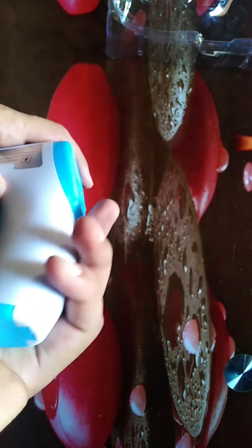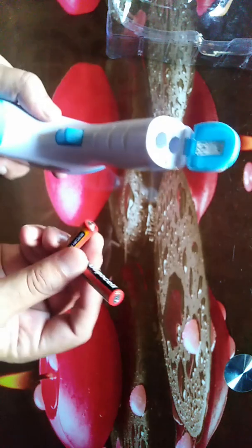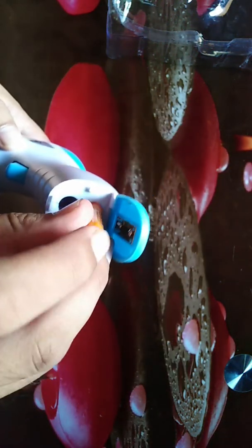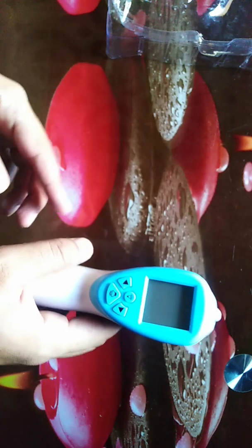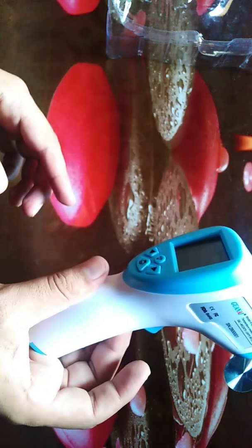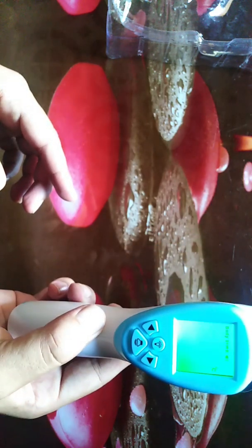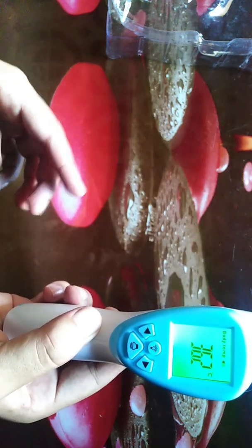You need to put the batteries in here. Be careful about the positive and negative connections. When you want to turn it on, you just press the button and it starts up.